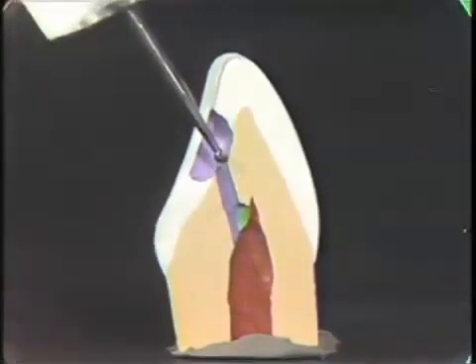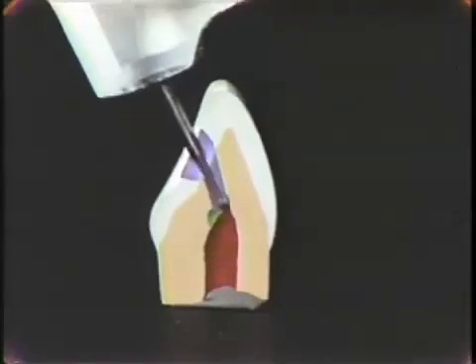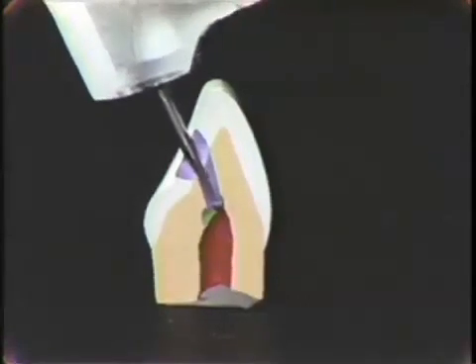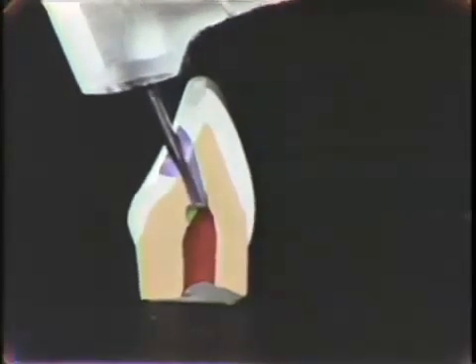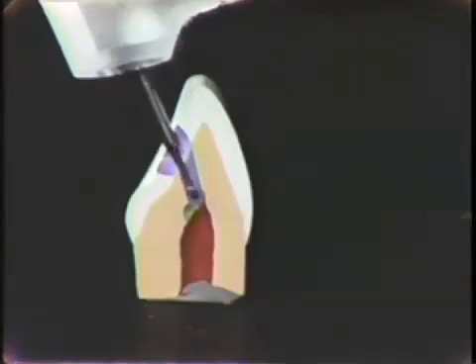Now, you won't be able to remove it in one pass, so you'll have to reinsert the burr. Feel again for the walls, keeping away from the wall of the pulp chamber, locating, in this case, the lingual roof of the pulp chamber, and once again unroofing, working from the inside out.